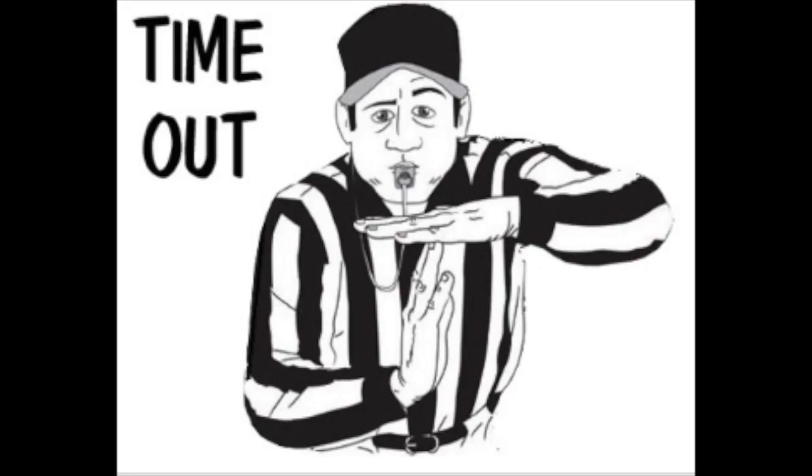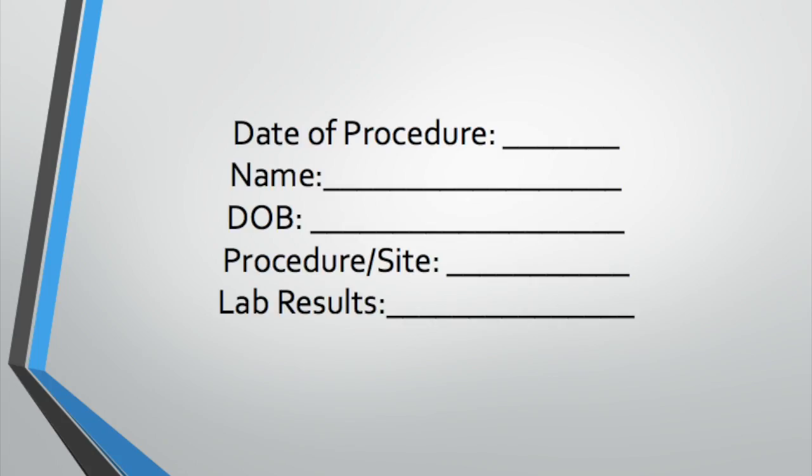A timeout should be given immediately before beginning the procedure. This process verifies the date, the patient's name and date of birth, the procedure order, prior imaging and lab results, and the site of the procedure.